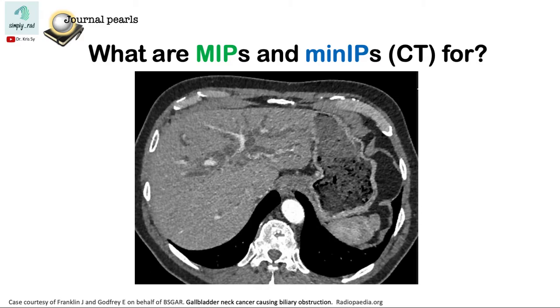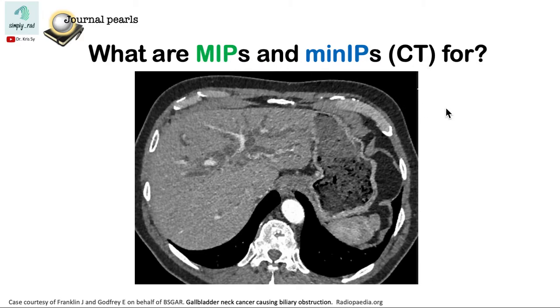Hi! You may have heard of MIPS and MinIP. Both are types of volume rendering techniques in CT. Each one has its own use, so let's start with MIPS.